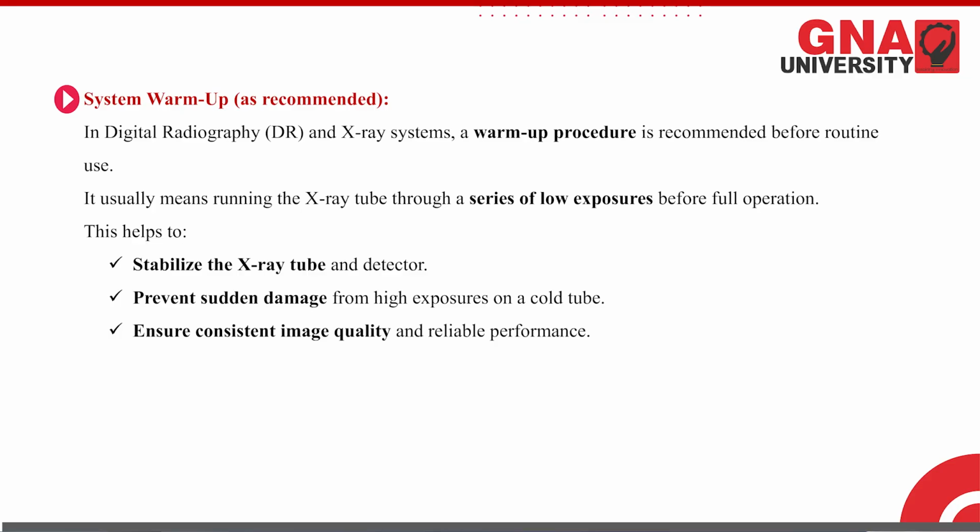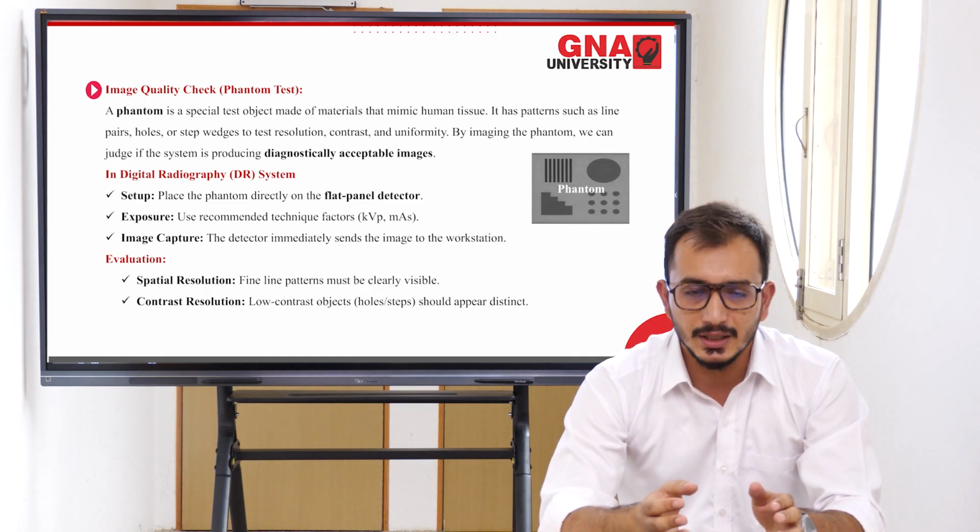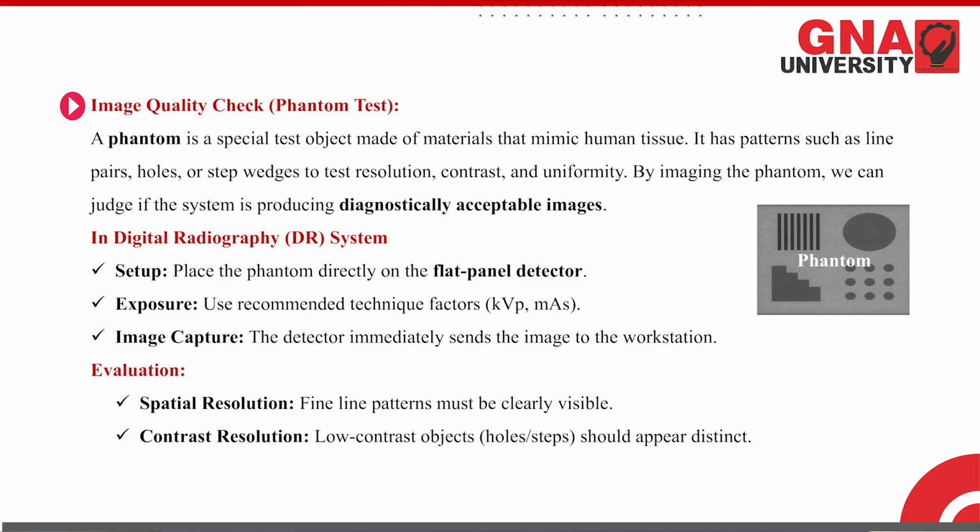The next test which we perform on a daily basis is the image quality check, and we also call it a phantom test. What is this phantom test? A phantom, simply we can call it, is a special object which acts the same as human tissue. It mimics human tissue, and it has several patterns, just like it is displayed here.